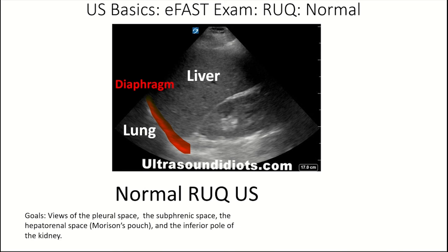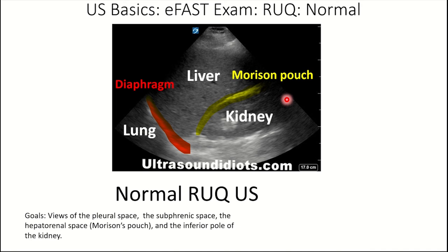The kidney can be identified by the hypoechoic black-appearing tissue with bright white tissue inside — that white tissue represents the renal calyces coming together to form the renal pelvis. In between the liver and kidney is Morrison's pouch, a potential space also called the hepatorenal recess. When doing this ultrasound, make sure you look at the pleural space, the subphrenic or subdiaphragmatic space, the hepatorenal space, and the inferior pole of the kidney.